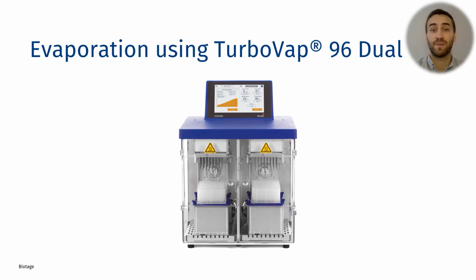Both the DOA and the THC panel were evaporated to dryness and then reconstituted with the details explained in the application notes. So the evaporation can often be overlooked during method development. It's a very important step, so it is vital to ensure that this step is suitable before proceeding with any further development. It is very easy to lose your analytes of interest at this stage, so I'd always recommend to do this in early method development. And I've got a few examples of where the losses of your analytes can occur.